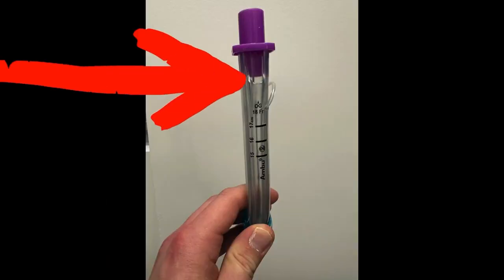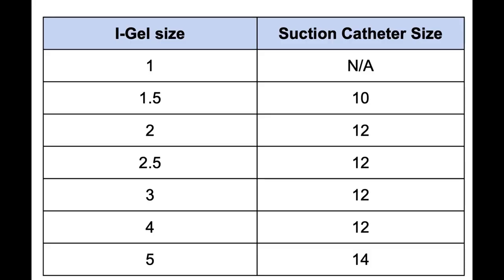Now we'll review King LTs for the services that have them. Some King LTs have gastric ports, as you can see here. The great thing about it is that it actually specifies the gauge or French catheter size you should use.